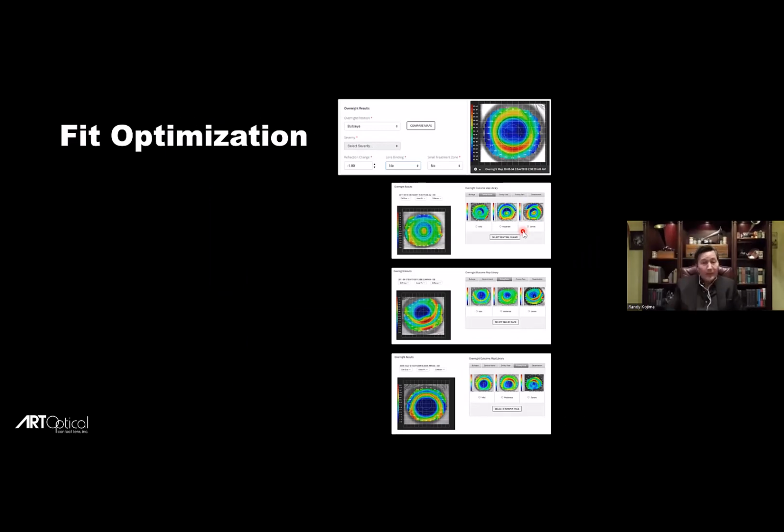So in every case, we're going to use this platform both to design the initial outcome, but also to problem solve when things aren't working perfectly. And we're going to go through some of this post-wear manipulation in the upcoming webinar. So the second webinar is on users who have a topographer that's linked to the Cat Cloud platform.